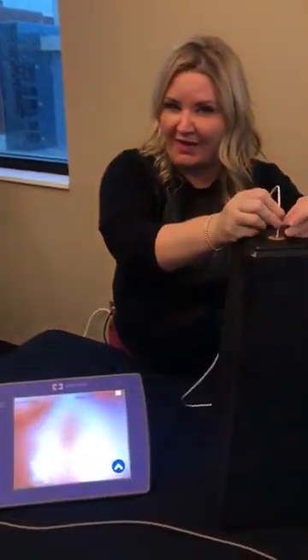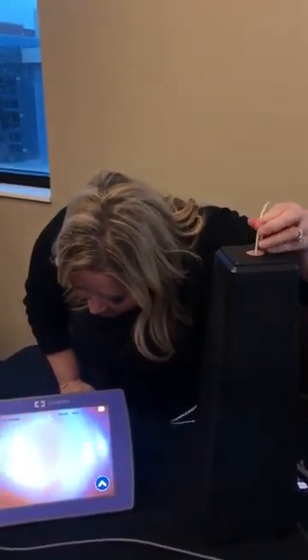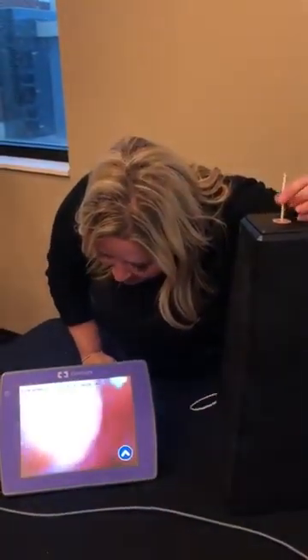So let's say we want to go post-pylorus. What we'll do is keep advancing until we see little villi. You might see some bile and more smooth muscle. So you'll see the muscular composition of the tissue change as we get post-pylorus. I think I keep getting stuck in here, but this is what happens when you use a model. Let's try this again. I'll pull back, and now I'm going to see if I can advance post-pylorus.